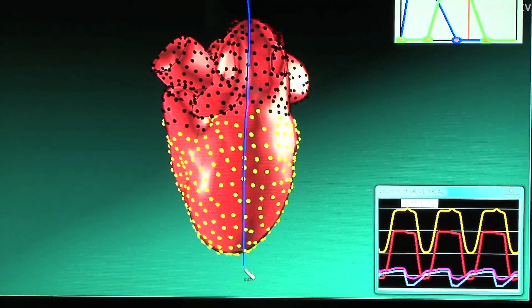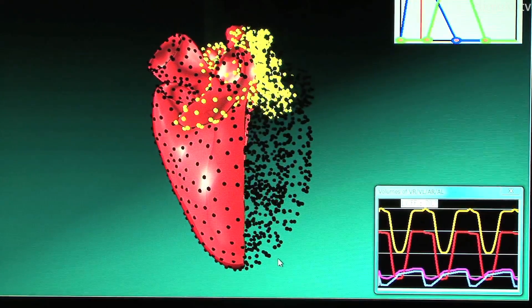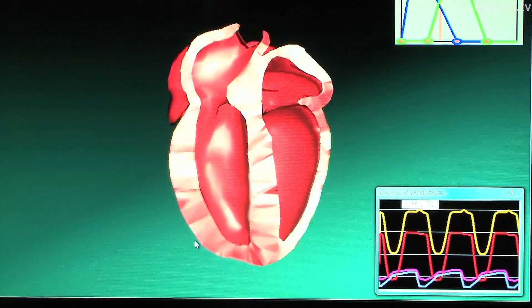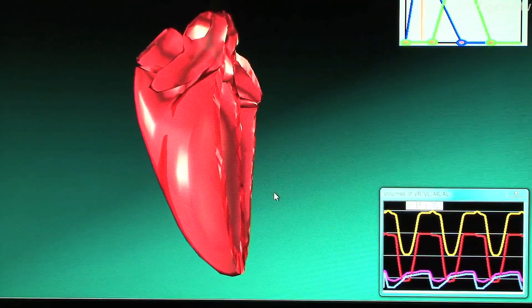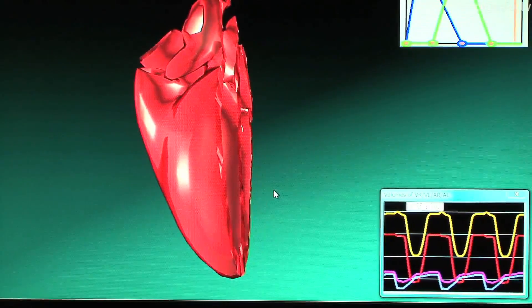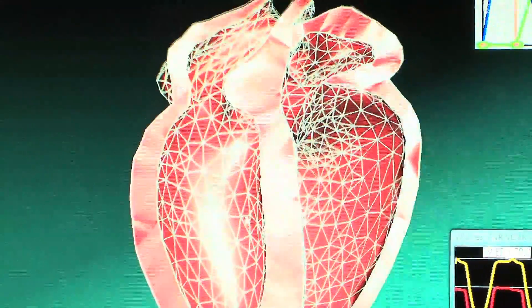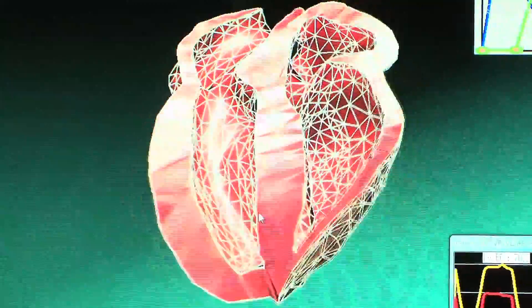Until now, simulating heart pulsation has required huge amounts of computing done by supercomputers or offline. But this new system makes it possible to visualize heart pulsation on a notebook PC in real time by applying computer graphics technology.